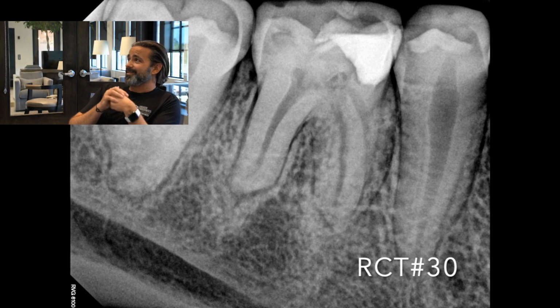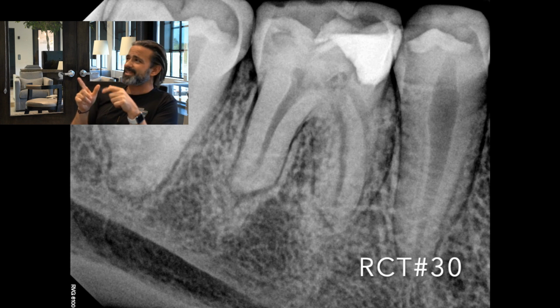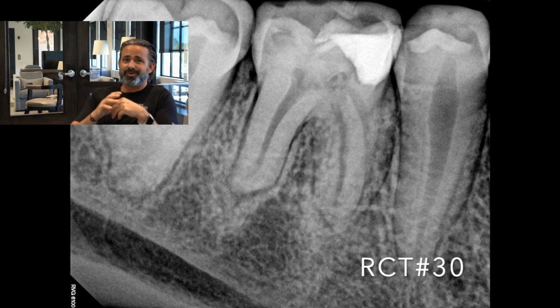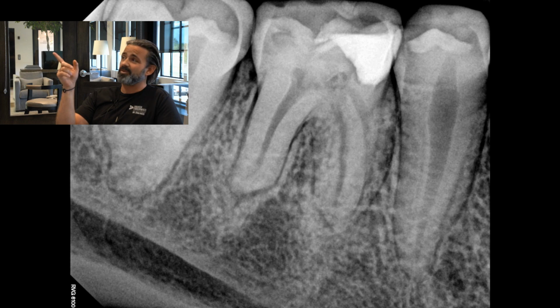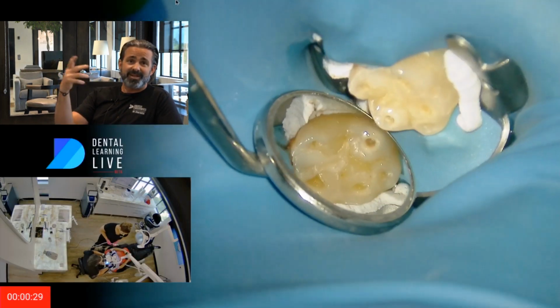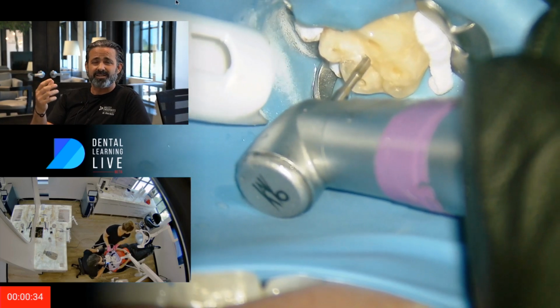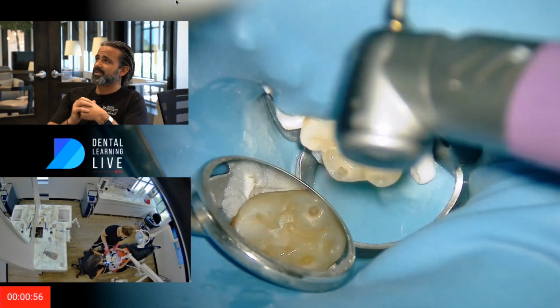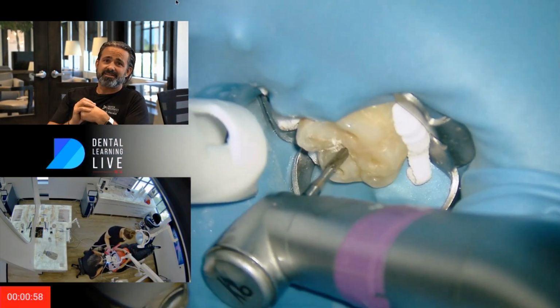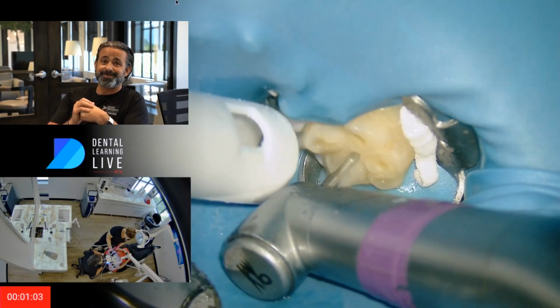Okay, so root canal number 30, like I described, pulp necrosis. There's always this deal with patients where the histological or clinical findings are different than the testing that we did. For instance, this tooth did not feel cold, and we diagnosed it as necrotic, but when I got in there, it was more of that ischemic tissue. There was still some organic matter in there, so it wasn't completely necrosis. It was the mostly dead scenario. For any of you that watched Princess Bride, mostly dead.